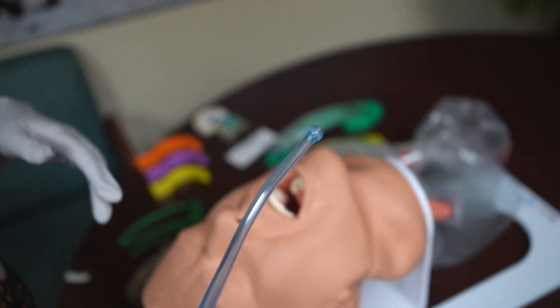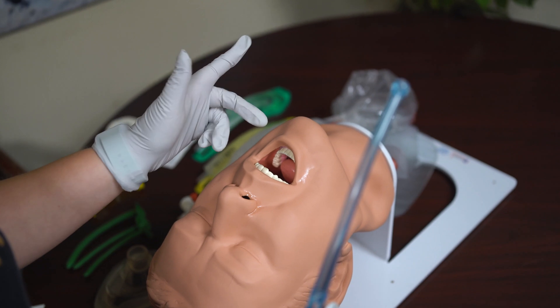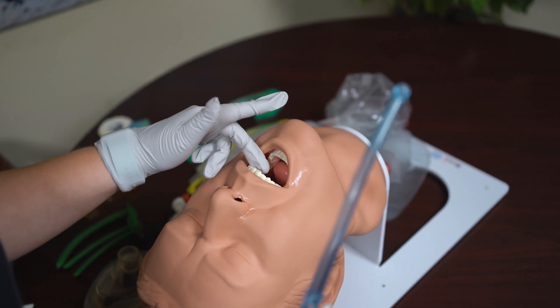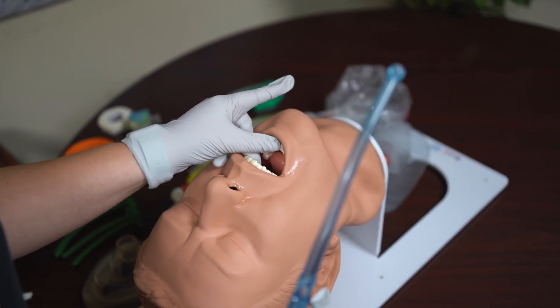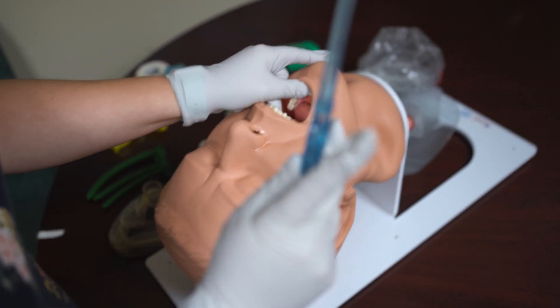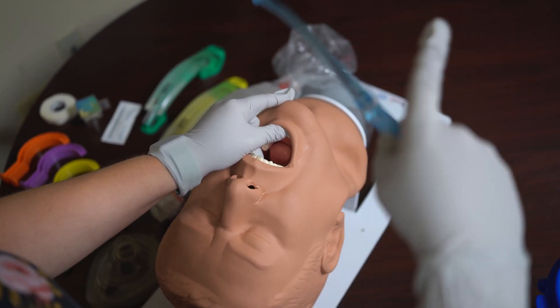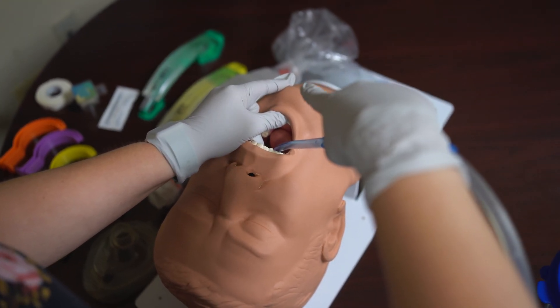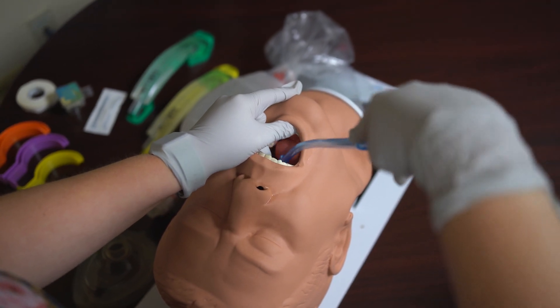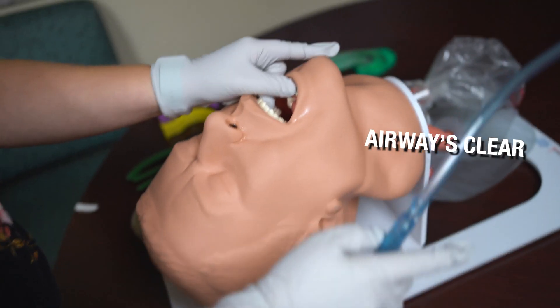I'm going to open the patient's airway with my middle finger and my thumb utilizing the scissor technique — my middle finger on the patient's top teeth, my thumb on the bottom teeth, pushing the mouth open. Without suctioning on the way in, I go in as far as I can see, then cover the hole and suction in a spiral circular motion on the way out for no longer than 15 seconds. The airway is clear.